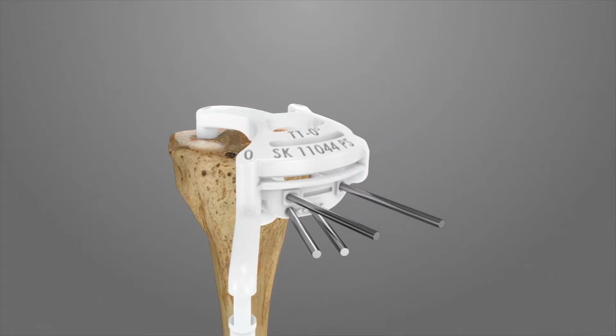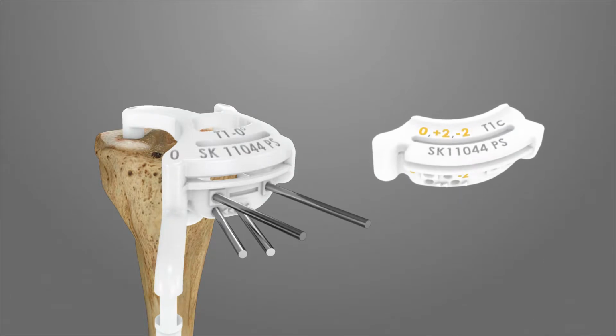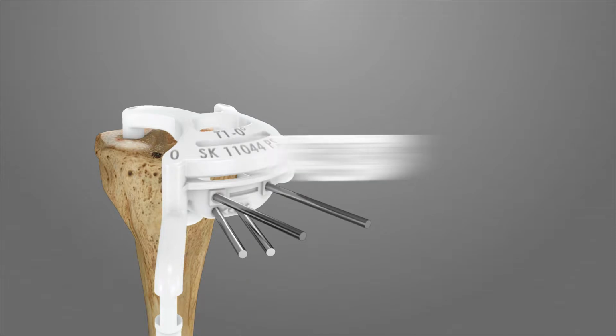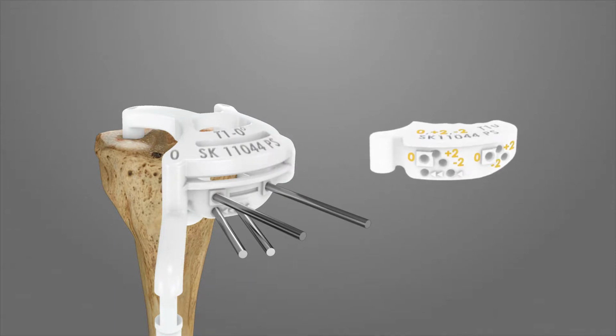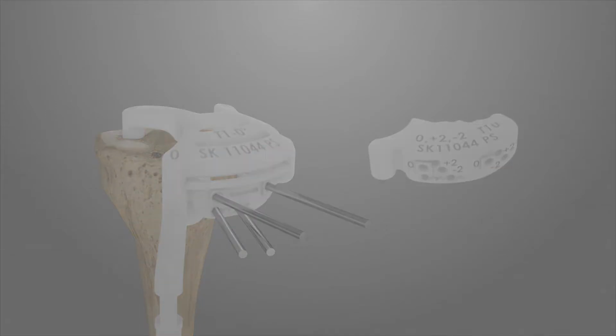There are +2 and -2 options on the tibial recut iJigs. If an additional 2 mm of bone needs to be resected, use the +2 pinhole position. If a more conservative tibial resection is desired, use the -2 pinhole position.